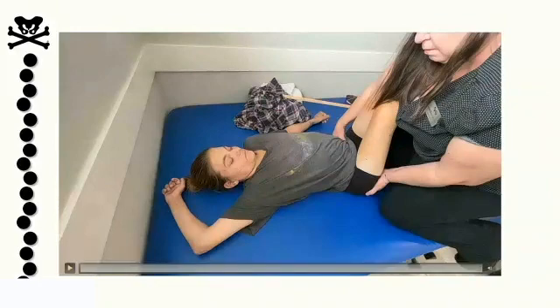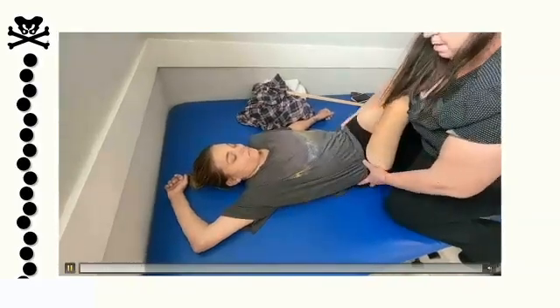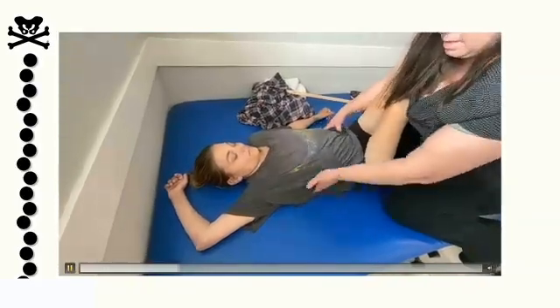So when we're doing our assessments, I encourage folks to not only assess how much flexibility they have towards neutral or towards the correction, but also how flexible things are in the path that we don't want them to go, or in the negative direction. So you'll see me check both of those things. Oftentimes there's plenty of room to go in the wrong direction and not quite enough room to go the way we want them to. So I'm just going to do the pelvic obliquity and see how easy things are.